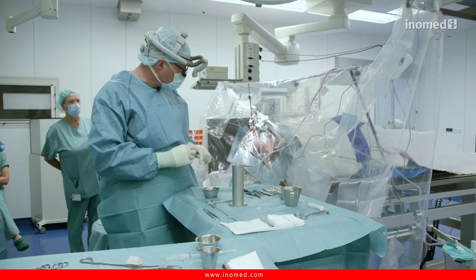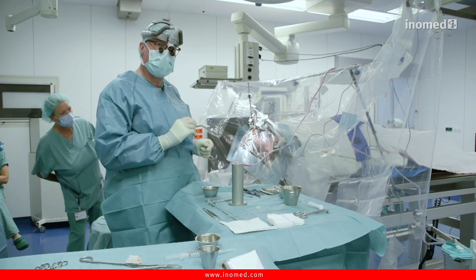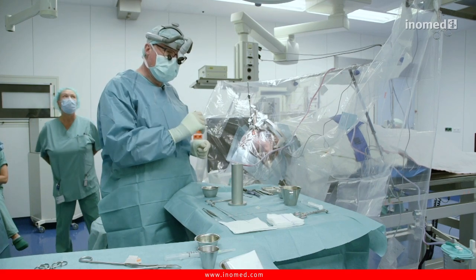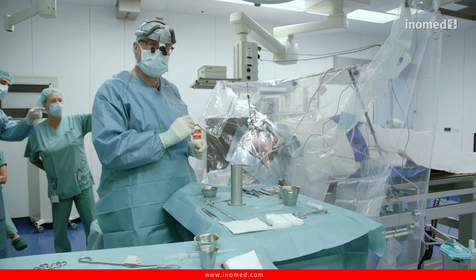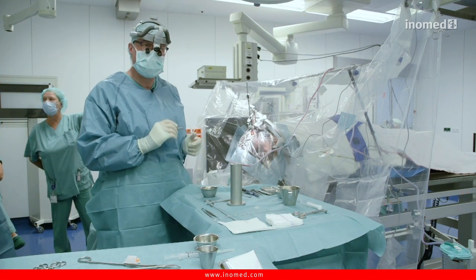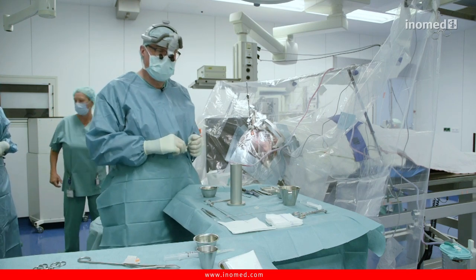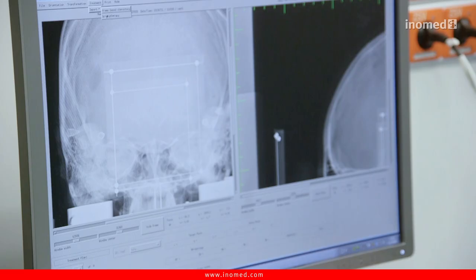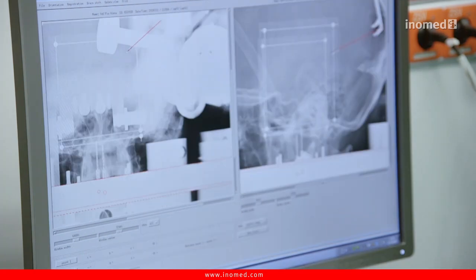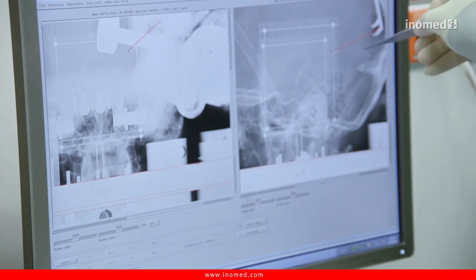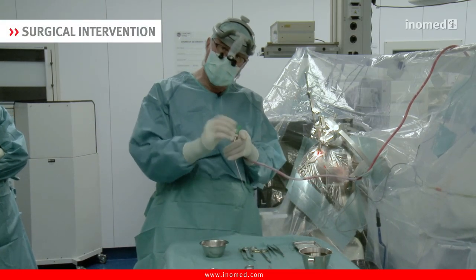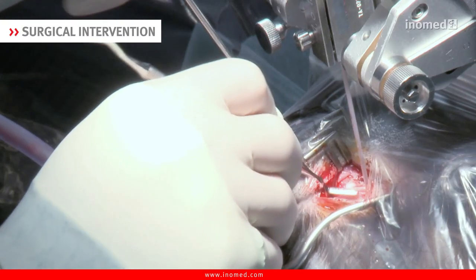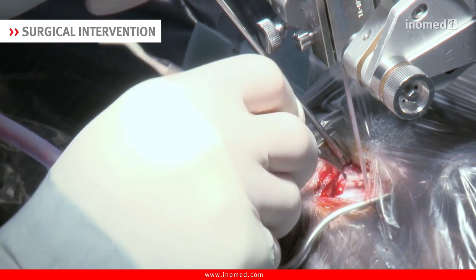This completes the seed implantation. In the next step we will take an X-ray to see if the location of the seed catheter matches the trajectory we have planned. We leave the room to do this orthogonal X-ray. The pre-planned trajectory is then superimposed and compared by medical physics with the actual image, and then we see whether the seeds are correctly located.